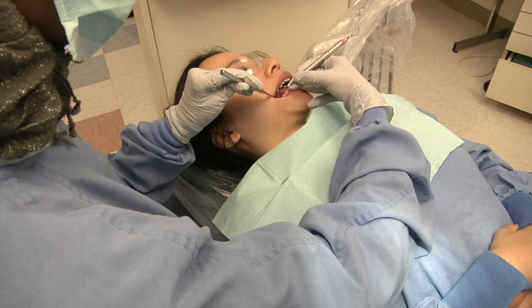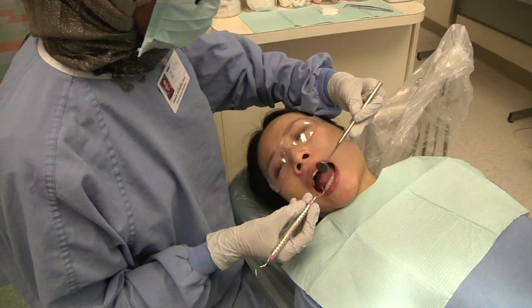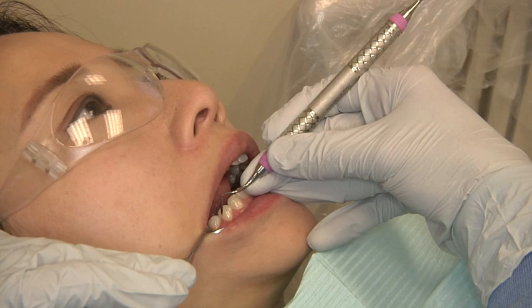Maintain optimal visibility and accessibility of the working area throughout the procedure by manipulating the use of the dental light, mouth mirror, and patient or operator positioning as needed. Avoid trauma to the tissues throughout the procedure by using a fulcrum at all times and using the instrument correctly so that the blade is always facing the tooth surface.